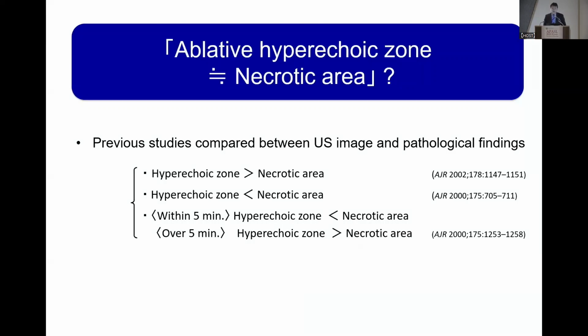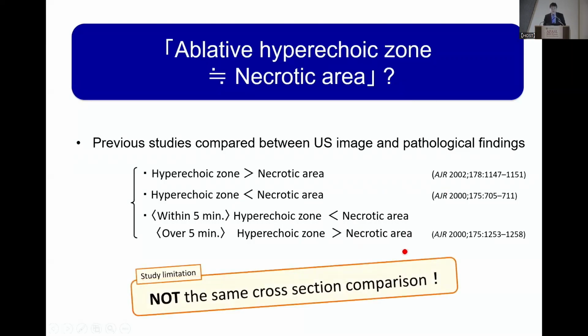However, another said the ultrasound estimation could depend on the time after ablation. However, these articles have the same limitation: they could not compare the same cross sections.